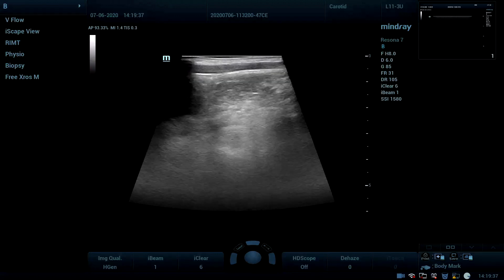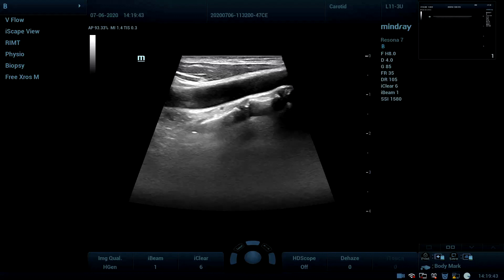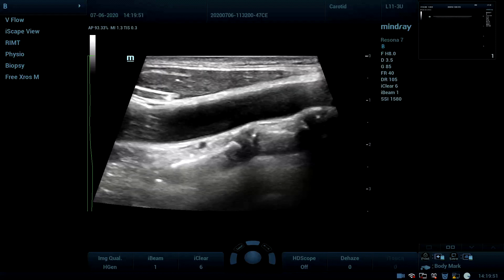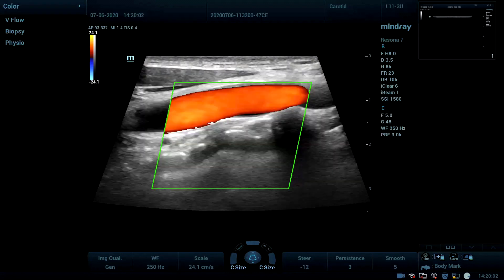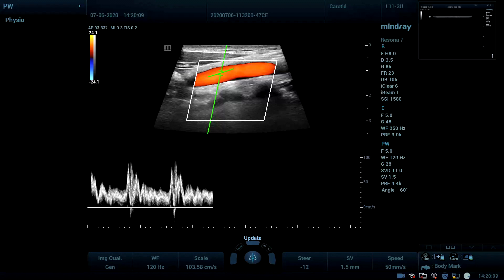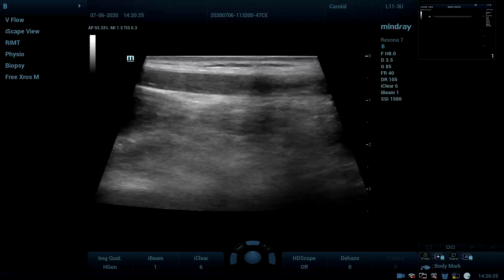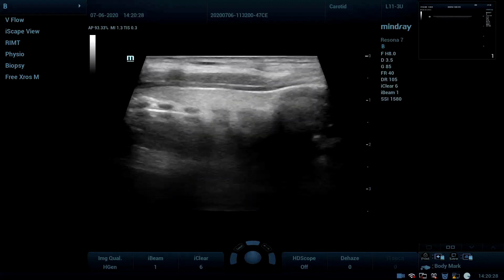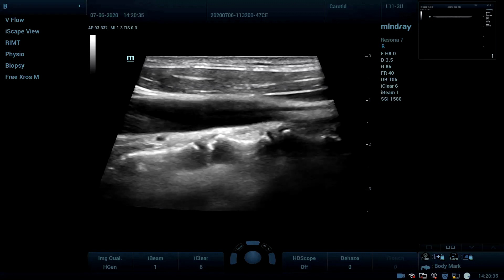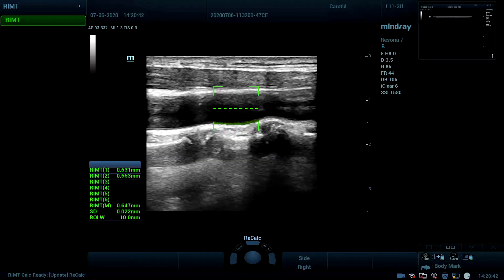First, I'm going to start with the 2D image of the carotid artery. As we can see together, a very detailed 2D image of the carotid artery. Measuring intima-media thickness with the conventional way is not that accurate because it depends on the 2D image quality. Here in Resona 7 we have the RIMT, radiofrequency intima-media thickness measurement in real time, up to 6 cardiac cycles.